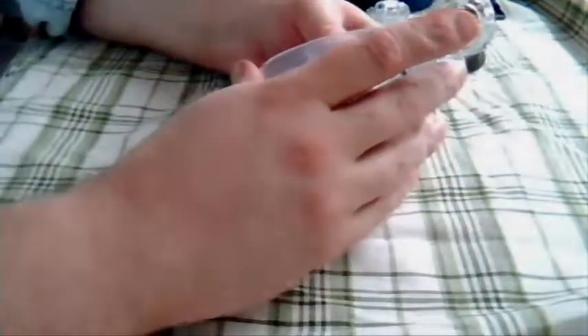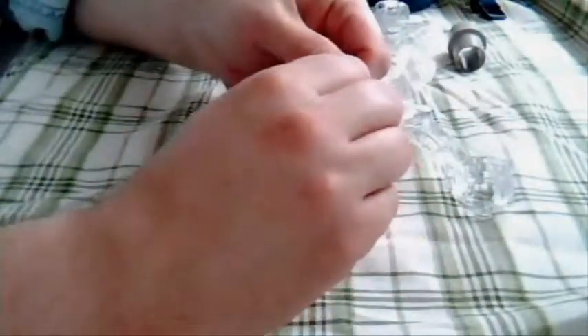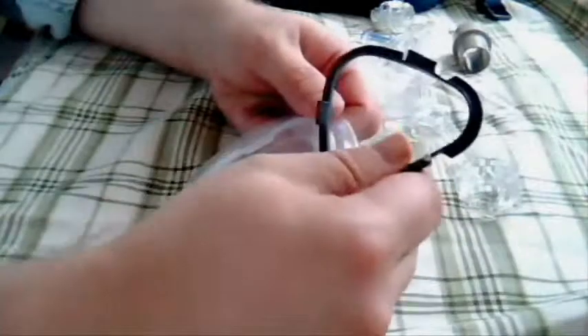When I said it reminds me a lot of the Quattro, the other Activa also has this and I'm going to go ahead and take this part off. If you remember how the Quattro goes together, this little piece of plastic slips into a ridge here - that's exactly what this mask does as well.